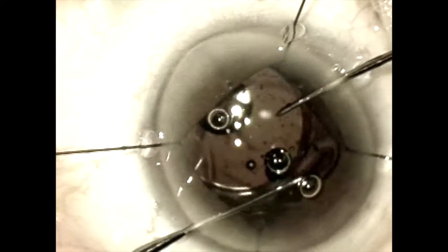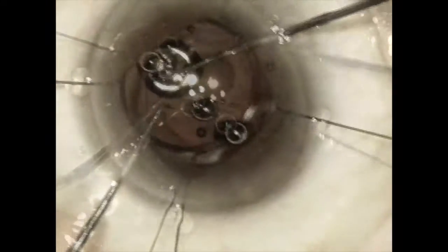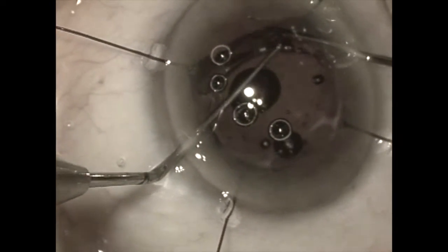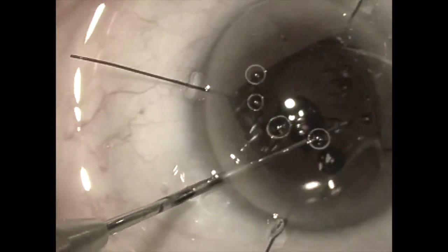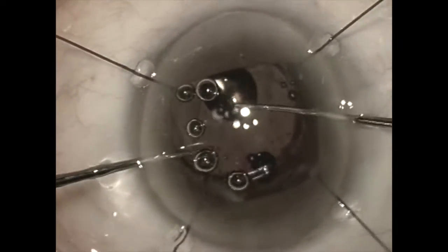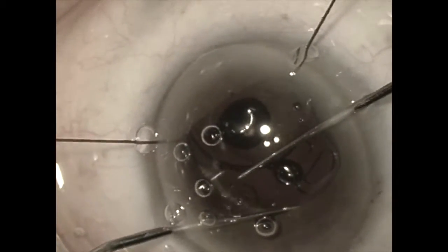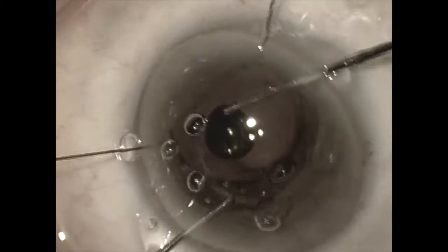The haptics are removed one by one and gently repositioned out of the bag into the sulcus. We have removed the temporal haptics and now we are gently lifting the nasal haptics up out of the capsular bag one by one and depositing them into the sulcus.